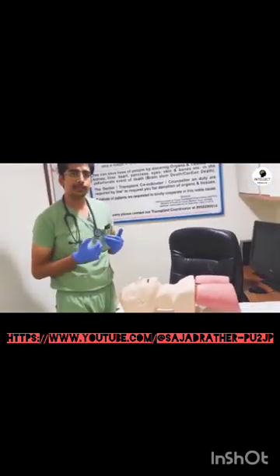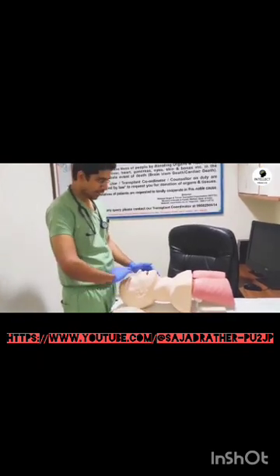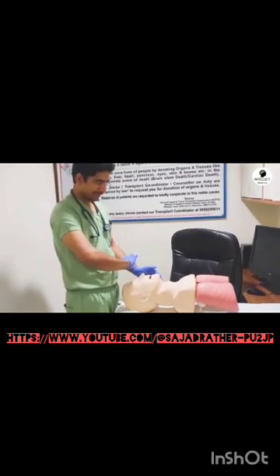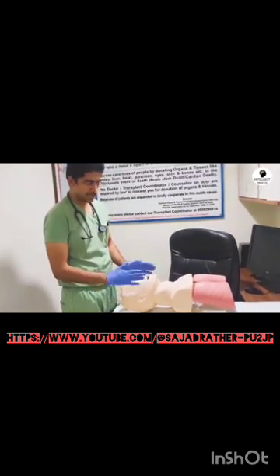First and foremost, when you are intubating a patient, the position of the patient as well as the position of the rescuer who is going to intubate is very important. The patient should be as near as possible to the rescuer, and the head of the patient should ideally be approximately at the level of the umbilicus. Although I don't have that bed over here, so I'll just demonstrate with this position, right?